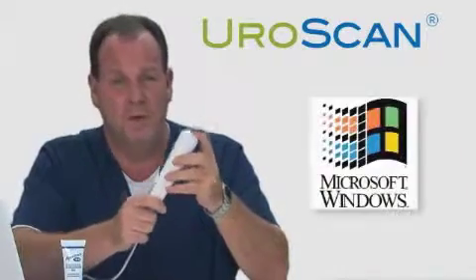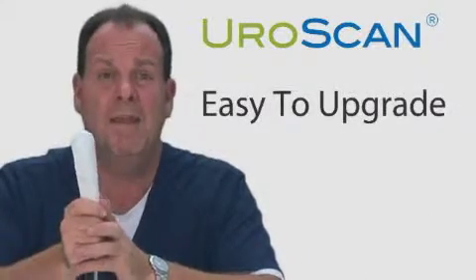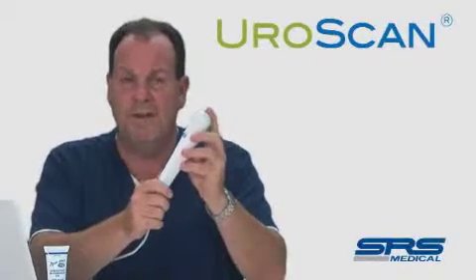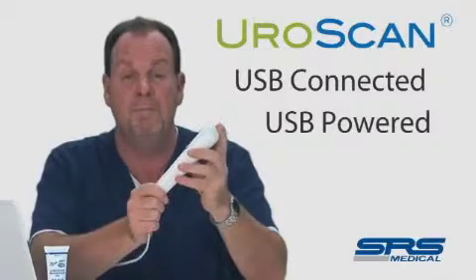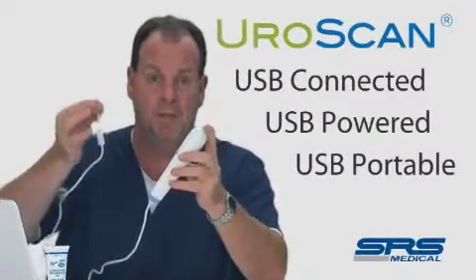The UroScan operates in a Windows environment, unlike a DOS environment. Changes and advancements can be made with no additional hardware required. Unlike DOS-based instruments, this device is connected to and powered by a computer, and can be moved from computer to computer literally by unplugging the USB port.